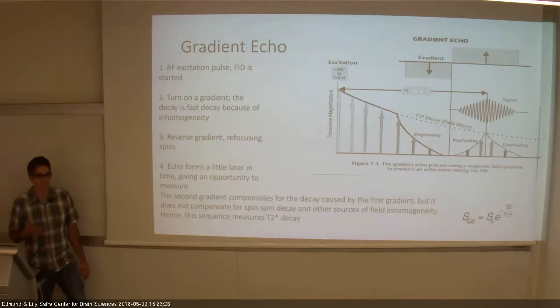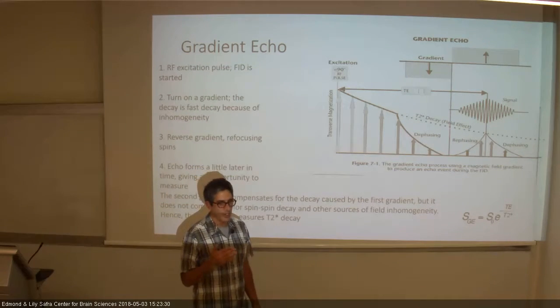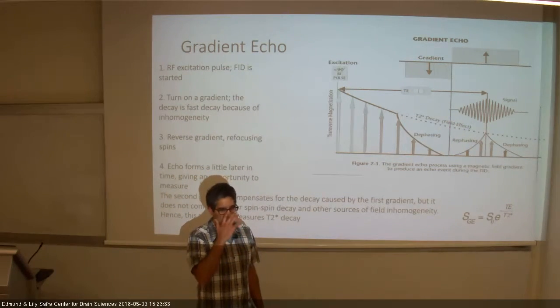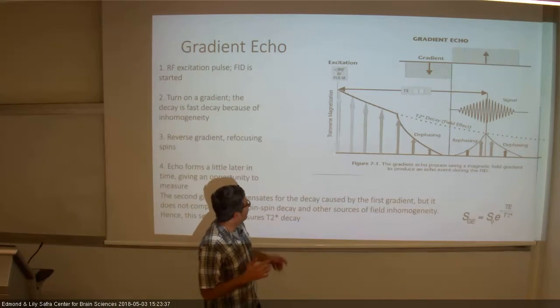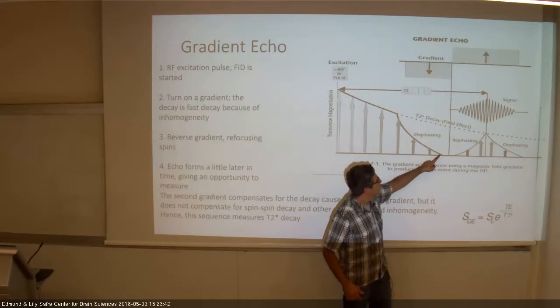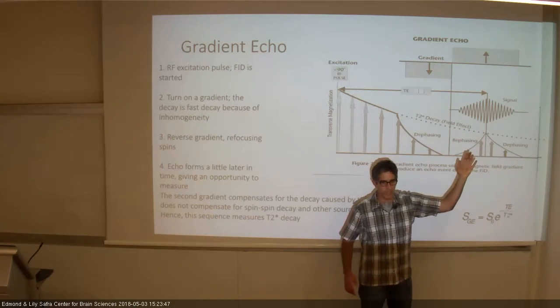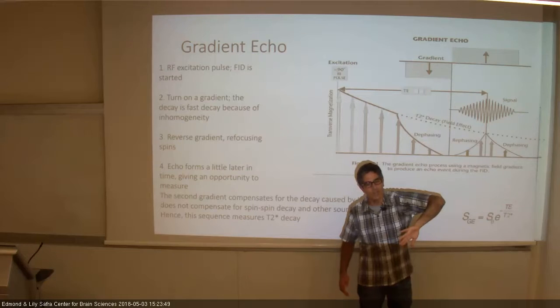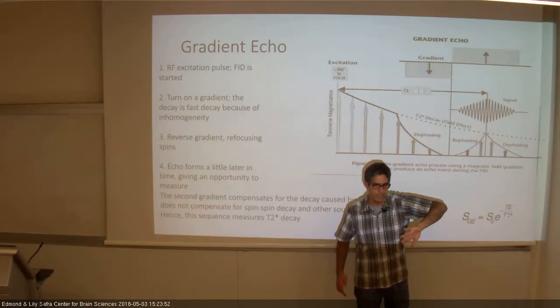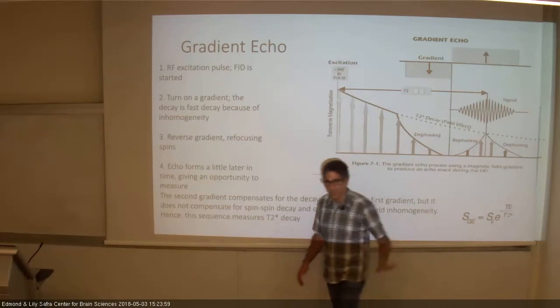I would just say that there is another manipulation which allows us to measure T2 star and not T2. Playing again, doing the same spin echo experiment but without the 180, still getting an echo. There is a way, using the gradient, of creating dephasing and then rephasing. That's creating another echo. I'm taking them out of phase, and then using just the opposite gradient, I'm bringing them back into phase. And that's creating an echo, which is very useful to measure the T2 star.